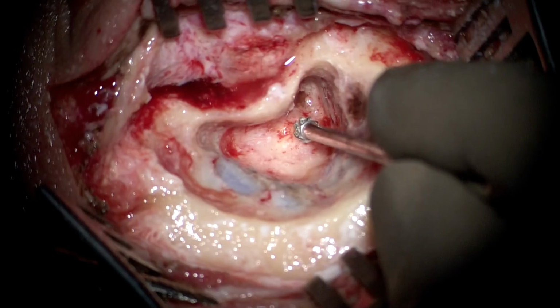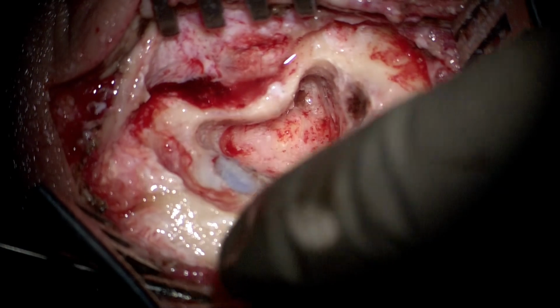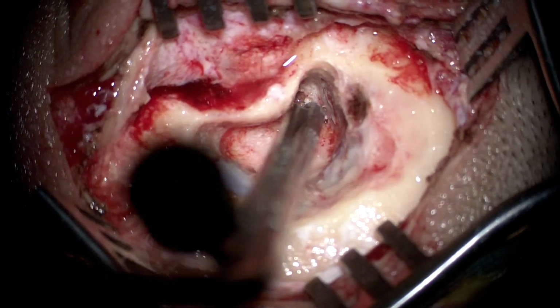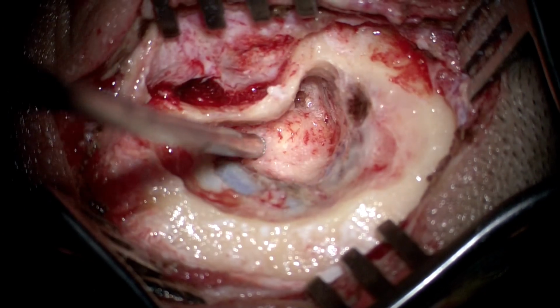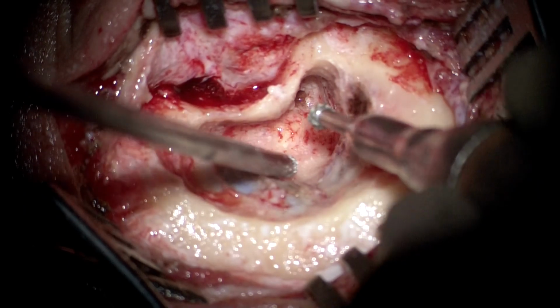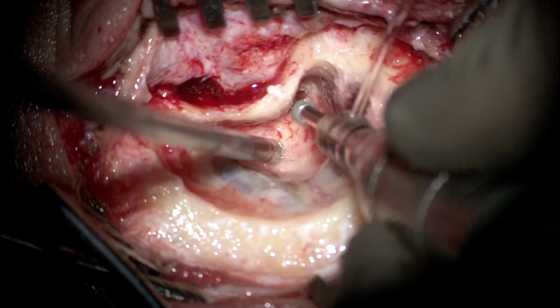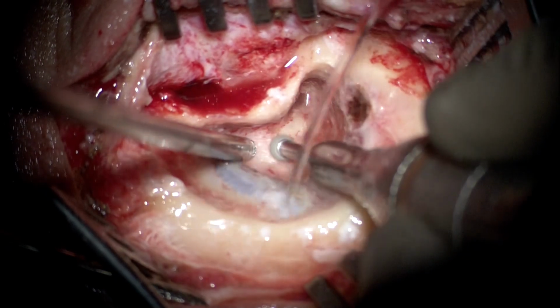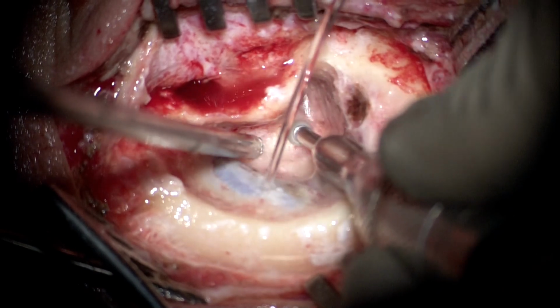And now that we have seen that, we can initiate our drilling using a small to medium sized cutting burr over the labyrinth, because the labyrinth is a hard block of bone. Using a diamond burr only would take us a long time to finish off the labyrinthectomy. So we begin with a small cutting burr, and as always we begin with the lateralmost canal, that is the lateral semicircular canal, followed by the posterior, and then later on by the superior semicircular canal.